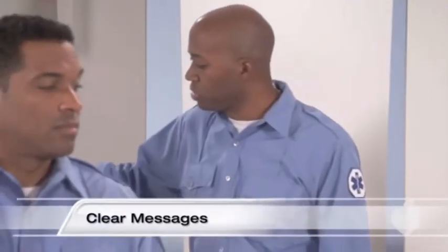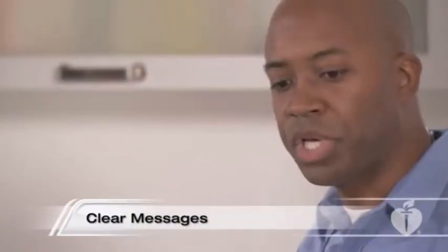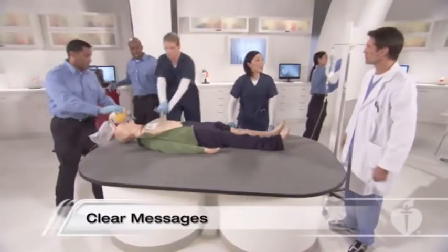Charging at 200 joules. Shock ready, clear the patient. Shocking on 3. 1, 2, 3. Shocking. Shock delivered. I have IO access now.